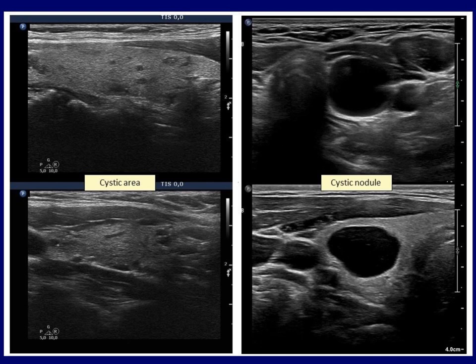The left thyroid presents numerous tiny cystic areas. These are less than one centimeter in maximum diameter and do not show solid parts. These correspond to dilated micro follicles. If we compare them with the nodule in the right images, the only difference is in the size of the regions. The right case proved to be a pure cyst because after the aspiration of the fluid, the region has completely disappeared.